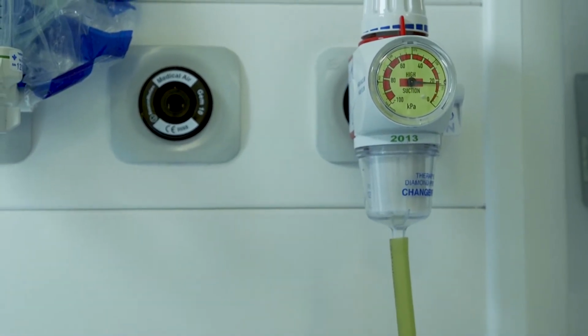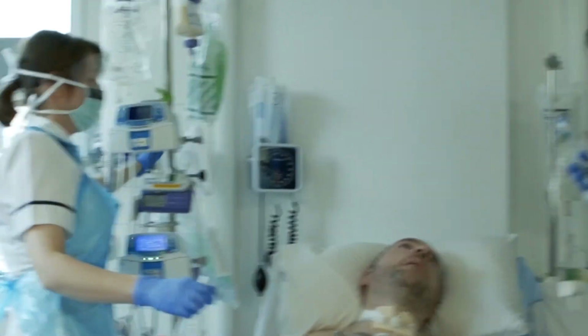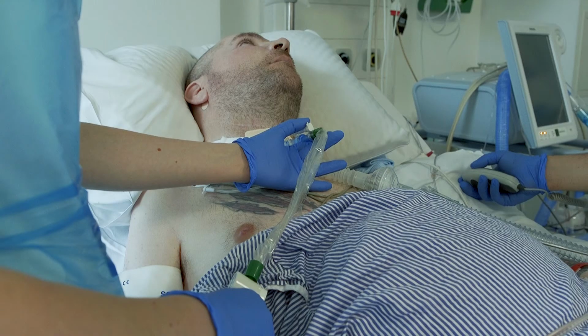Once you are happy with the suction pressure, the suction tubing can be attached to the end of the closed suction catheter ready for treatment. The physiotherapist will also unlock the suction on-off knob, which is attached to the closed suction mount prior to treatment so that suction will be ready to apply during the physiotherapy treatment.